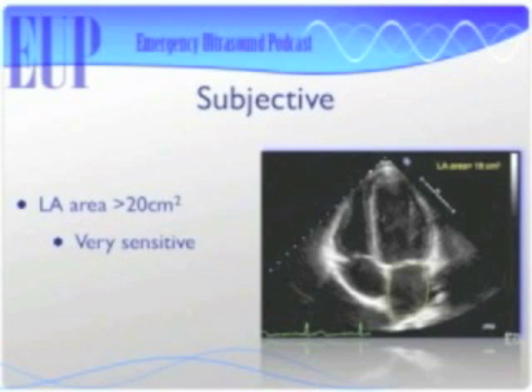You can measure area pretty easily on most ultrasound machines by just hitting that measure button twice. Usually the next thing that comes up is the area.